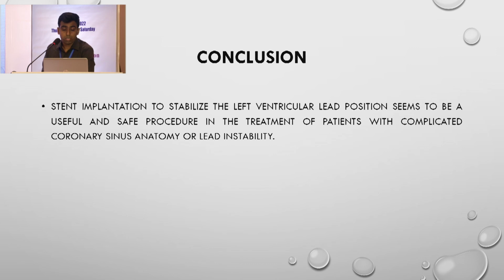So in conclusion, stent implantation to stabilize the left ventricular lead position seems to be a useful and safe procedure in the treatment of patients with complicated coronary sinus anatomy, or lead instability due to size discrepancy.